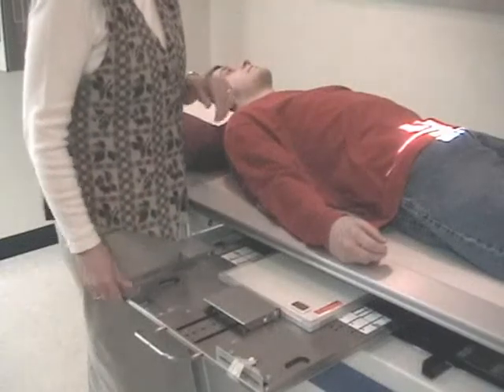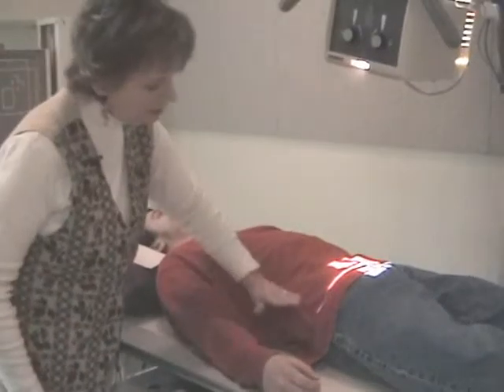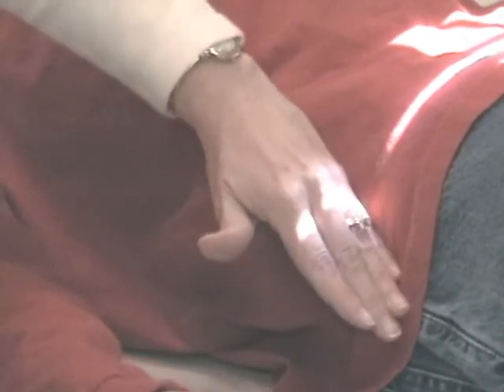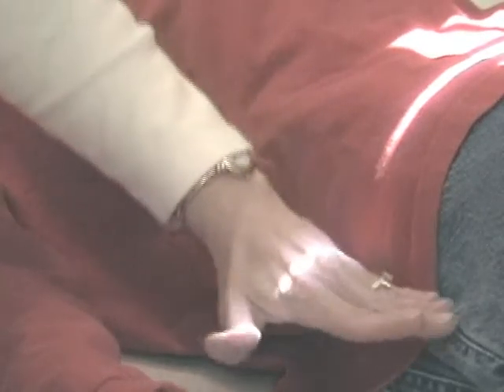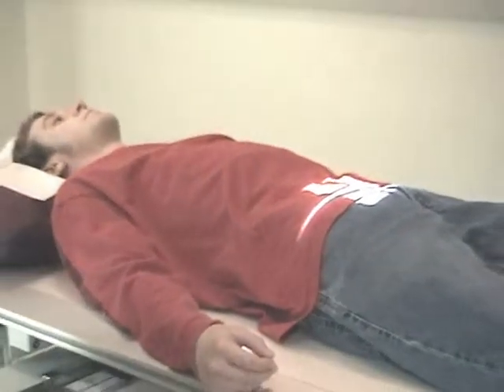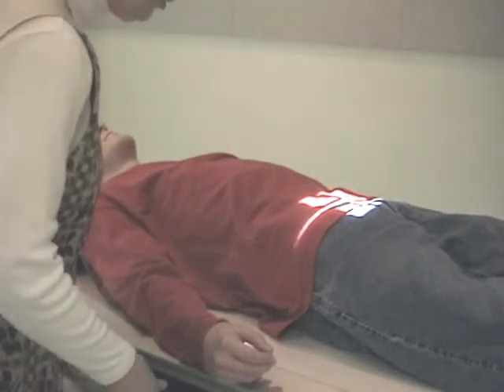My tube is angled 15 degrees cephalic. 15 degrees cephalic because the sacrum, here's the patient's back, angles down. That's why we need the cephalic tube angle, so you can be perpendicular to it. Then it curls up with the coccyx, and when we do the coccyx, we will have a caudal tube angle. I've adjusted the gauge, so I've maintained 40 inches. Gauge says 37 for a 15-degree cephalic tube angle.